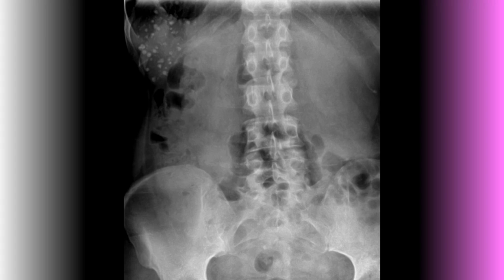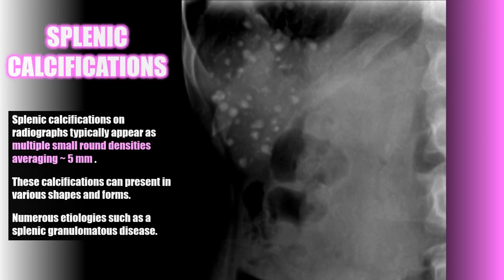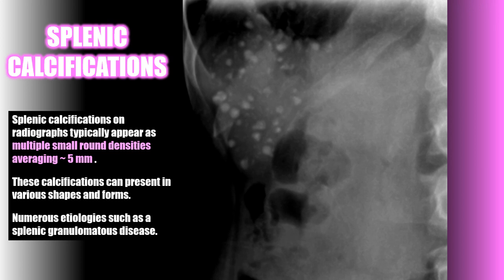On this radiograph you should notice multiple focal areas of soft tissue calcification in the left upper abdomen within the expected region of the spleen. Splenic calcifications typically appear as multiple small round densities averaging about five millimeters in size. These calcifications can present in various shapes and forms and can be caused by numerous etiologies, such as splenic granulomatous disease.